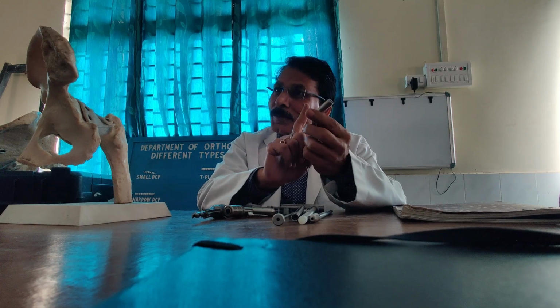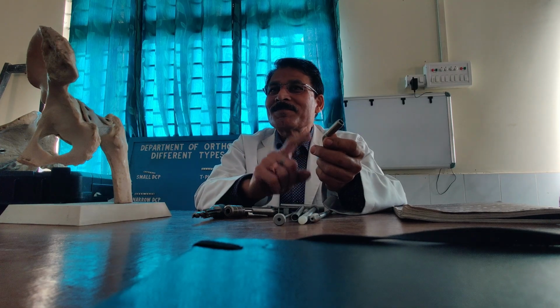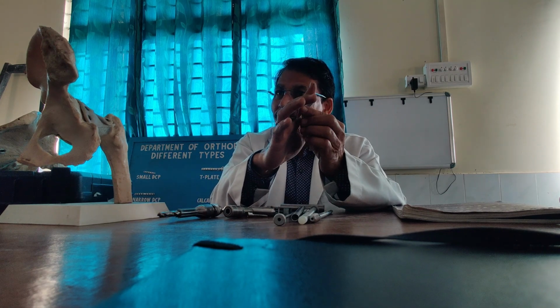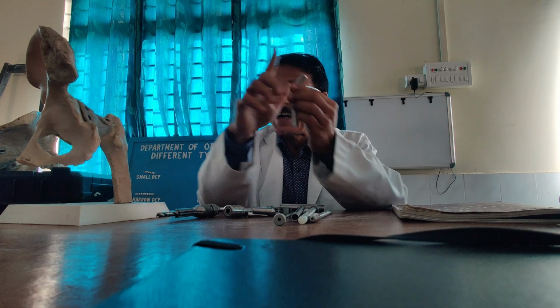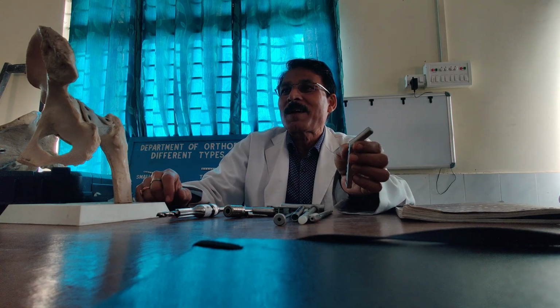Less than 1. Almost 150 degree. But why are you selecting 150 degree? The question is that if you are going to give a plate like this, almost 150 degree, then the entry point will essentially come down. In fractures, if the angle is like this, then I have to have an entry point down below the lesser trochanter. So this is the area which is going to go in fact.